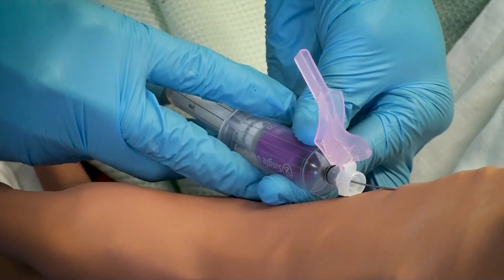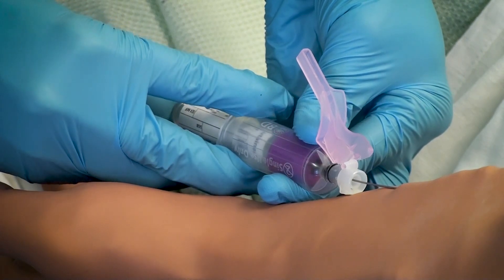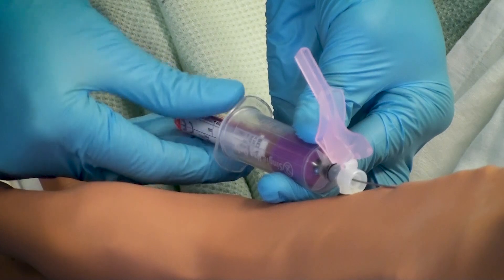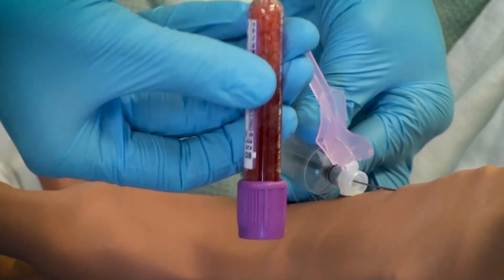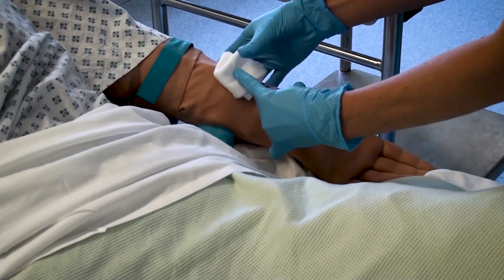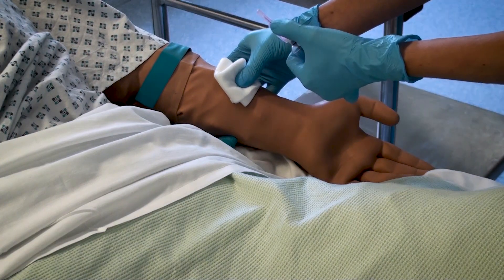Remember that for certain samples, such as the blue bottle used for clotting and INR, you must fill fully to the line. Ensure that all samples are mixed appropriately by rocking. Once you have obtained all your samples, release the tourniquet before removing the needle, then remove the needle in a single smooth movement.